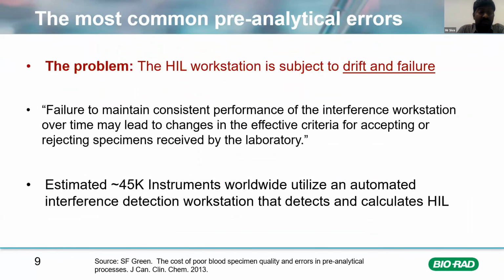The failure could be in maintaining the consistency of the HIL module's functioning. When it is running over time, like in a 24-hour laboratory, that can lead to changes.